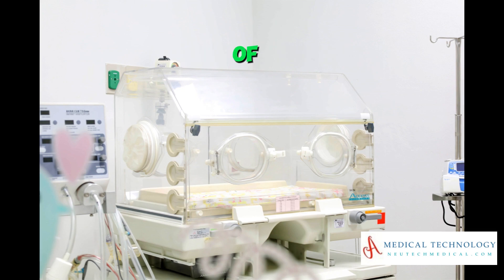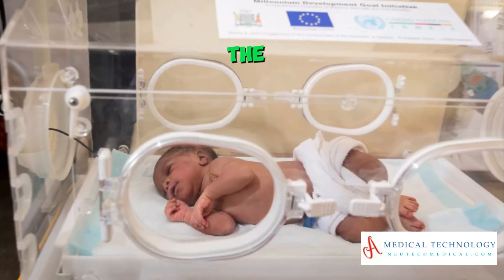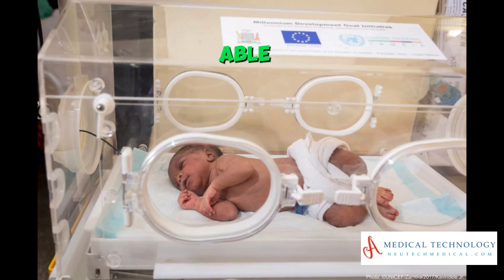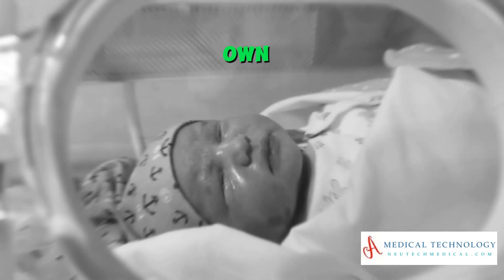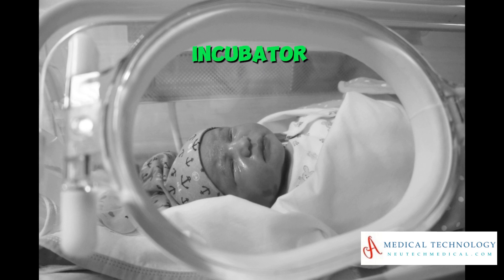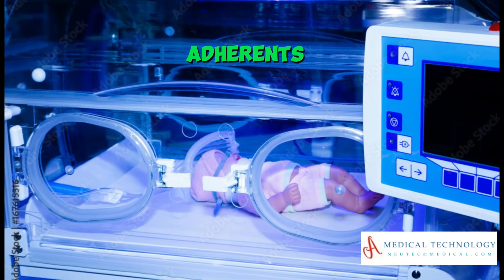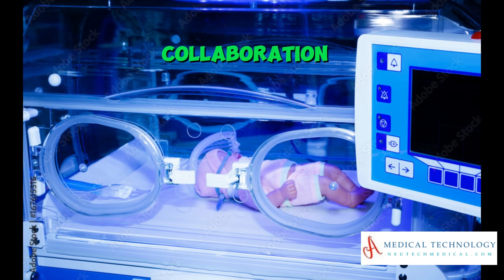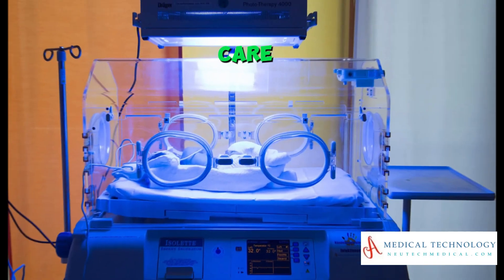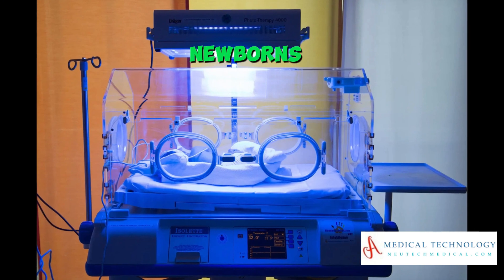Discontinuation of incubator use: Gradually transition the infant out of the incubator once they are stable and able to maintain body temperature on their own. Overall, the proper use of a baby incubator requires attention to detail, adherence to protocols, and collaboration among healthcare professionals to optimize the care and development of premature or ill newborns.